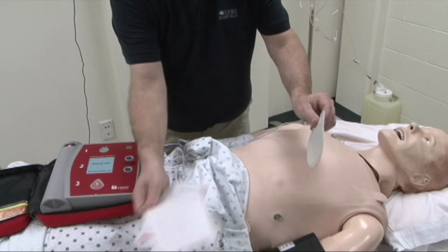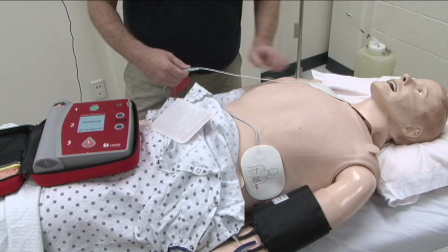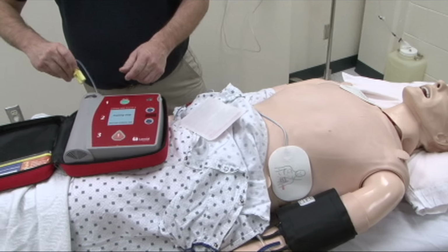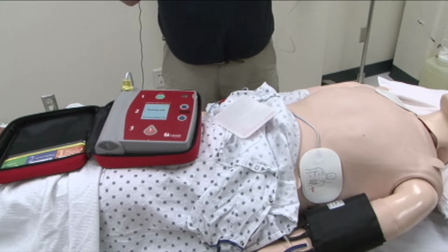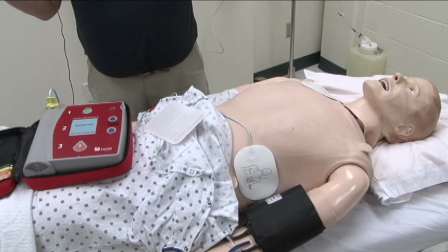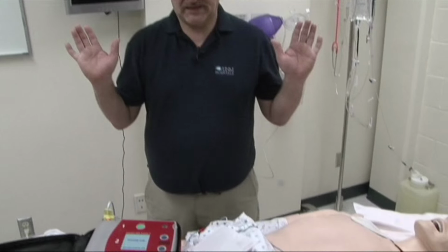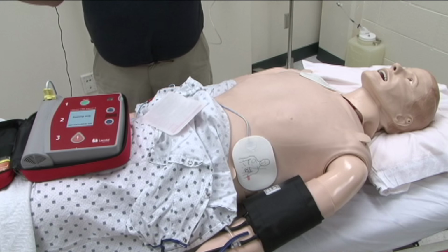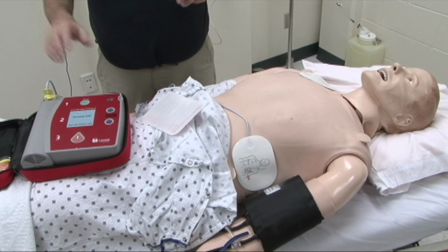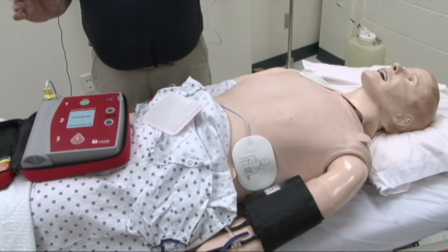Apply pads to patient's bare chest. Plug in pads connector next to flashing light. Analyzing heart rhythm. Do not touch the patient. No one touching. Stand clear. Shock advised. Charging. Everybody clear? Stay clear of patient. No one's touching? Deliver shock now. Press the orange button now. Shock delivered. Paused. Begin CPR.